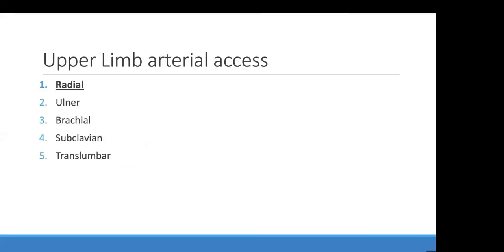There are many ways of using the access for coronary angiography. You can use the radial, and nowadays the new kid on the block is distal transradial. I'm not a big fan of it because it increases the procedure time. Why? But it's a good alternative. It's always good to have something in your pocket that others don't have. So if you can do it, do it.